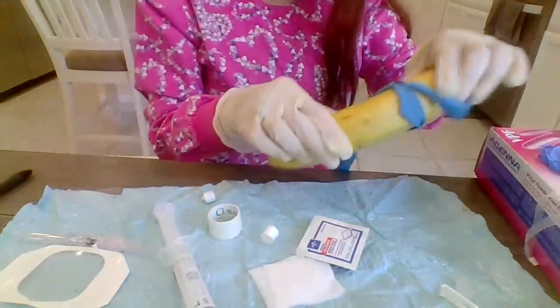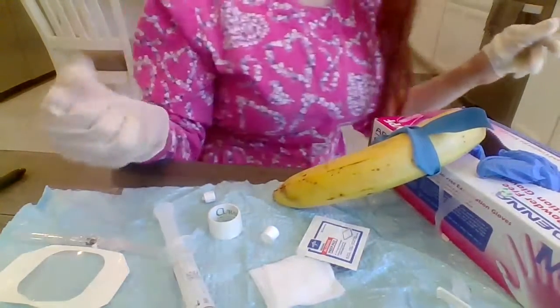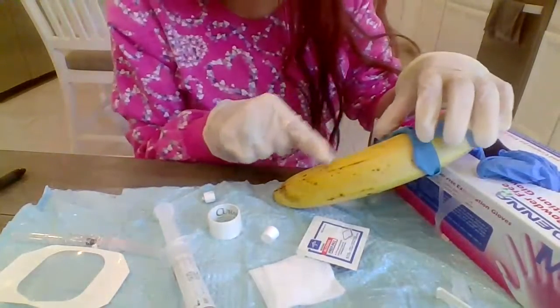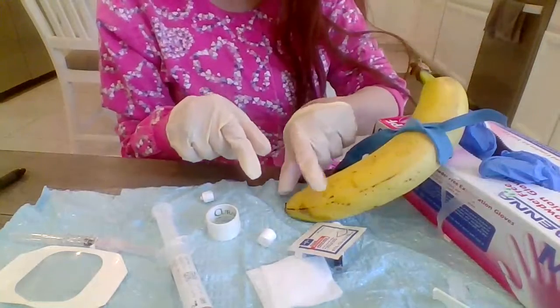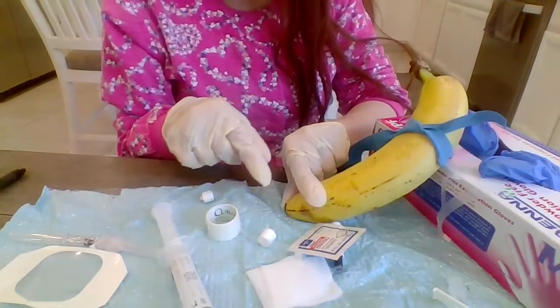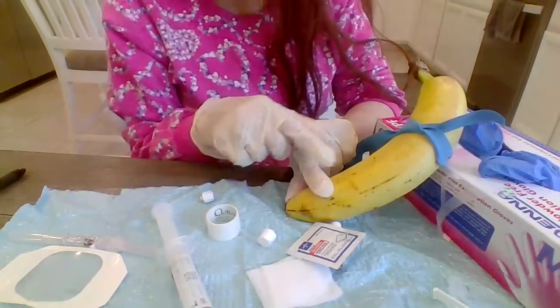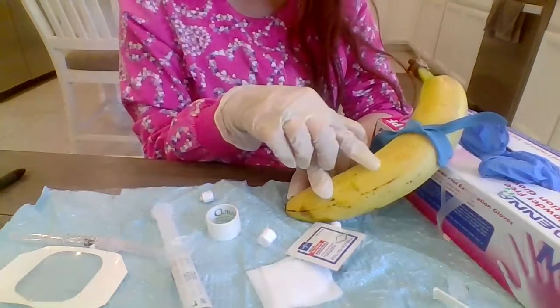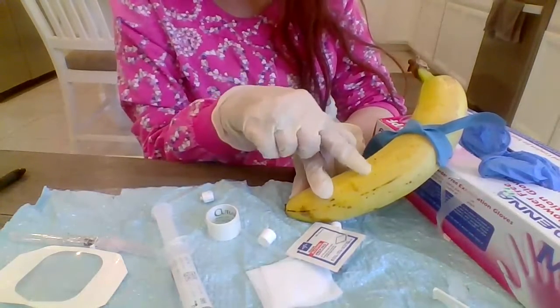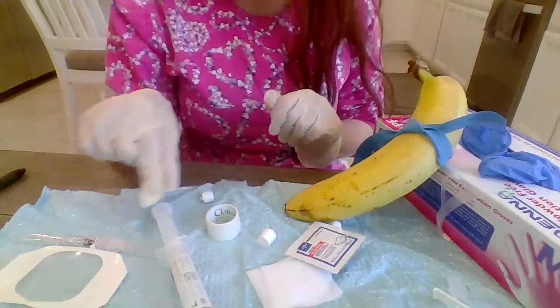Okay, so ask Miss Banana to pump her fist, and now I can see there's a vein coming out, and I'm going to go ahead and pull back and see. Okay, I can see a straight vein for a good IV insertion site. So I'm going to go ahead and disinfect the area.